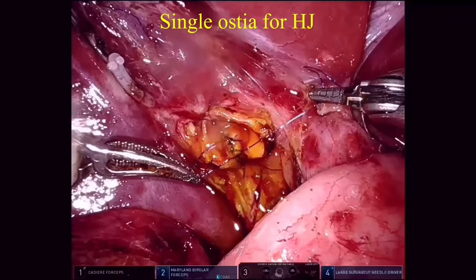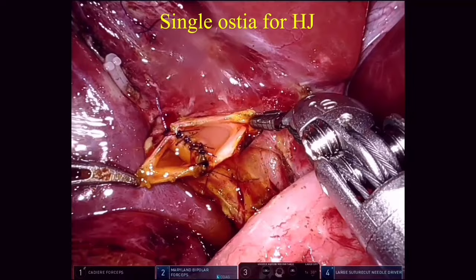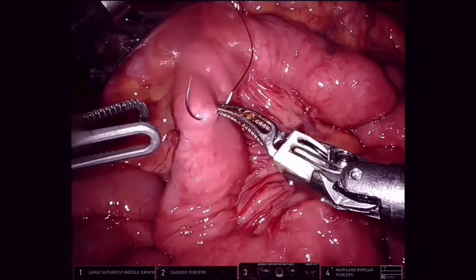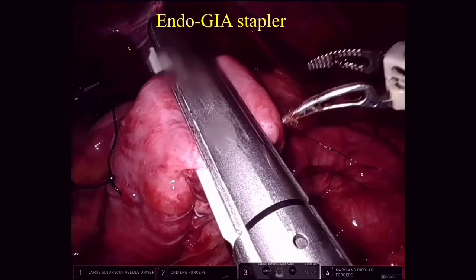We take interrupted sutures at regular intervals with the aim of doing a single ostia hepaticojejunostomy. The single ostia for hepaticojejunostomy is ready. Next, the DJ junction is identified. Different coloured sutures are used for marking proximal and distal. A mesenteric window is created and an endo-GIA stapler is fired to create a Roux limb.